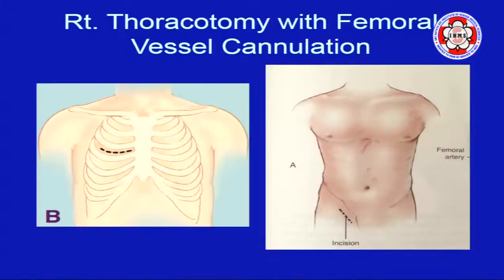So it's a conventional right thoracotomy, followed by the femoral cannulation. Again, for cannulation purposes, I'll go into this tomorrow with re-op and everything else, but I prefer to use the left femoral, even the one depicted here. The reason is most people have cardiac catheterization scar tissue in the right femoral, so I prefer to go on the left side.